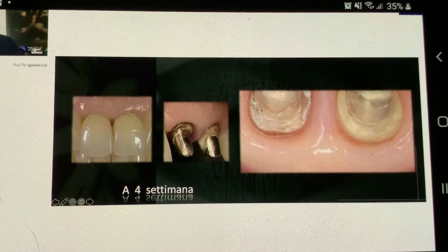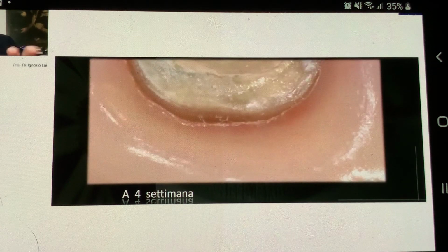So in the space where we have a narrower preparation, we have more compensation of gingival growth, and here where we have a preparation which is a bit wider, tissues have less thickness. What is important to see is that if we put an emerging volume that is the same, the tissues respond in a symmetric way.